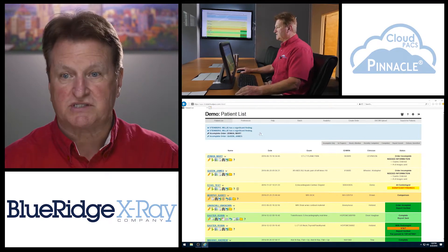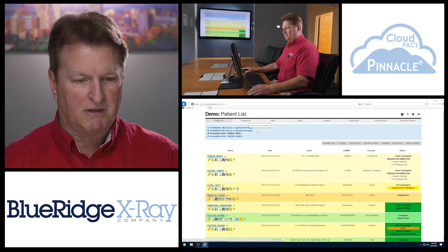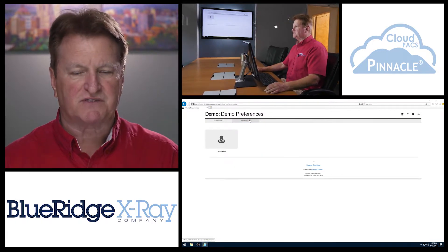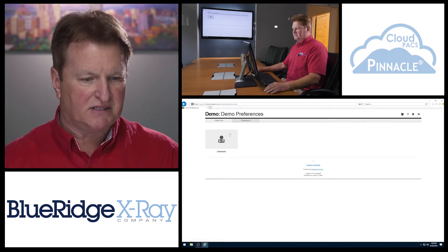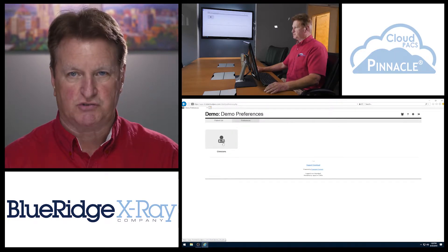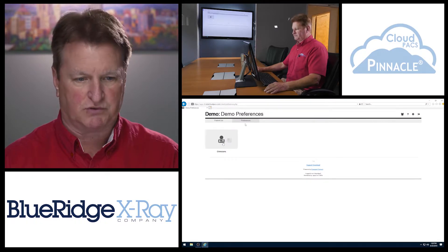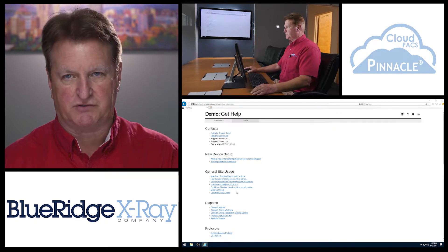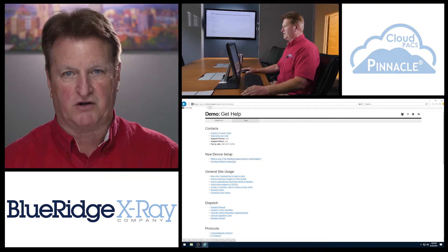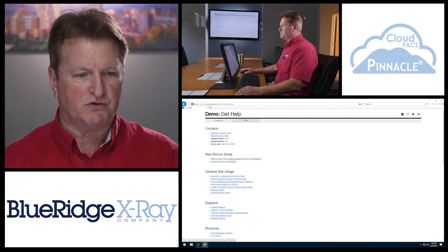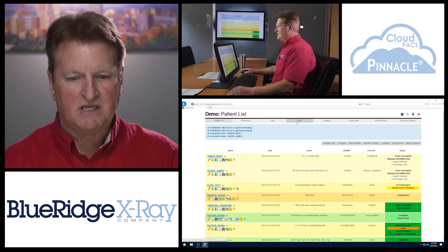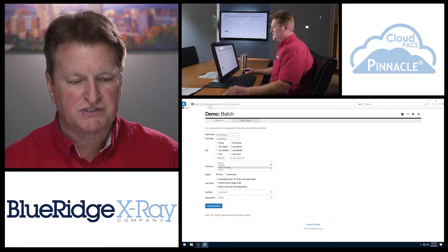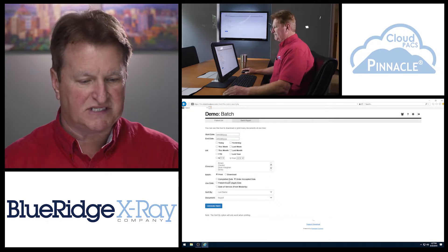I wanted to first discuss some of the admin features of the Pinnacle Packs. The first one being preferences — under preferences, an admin can set up different clinicians and users with privileges and passwords. The help screen lists all of the features of the Packs and helps you figure out what area to go to if you get confused about functionality. The batch screen allows you to filter through different providers, types of studies, or even exam dates.